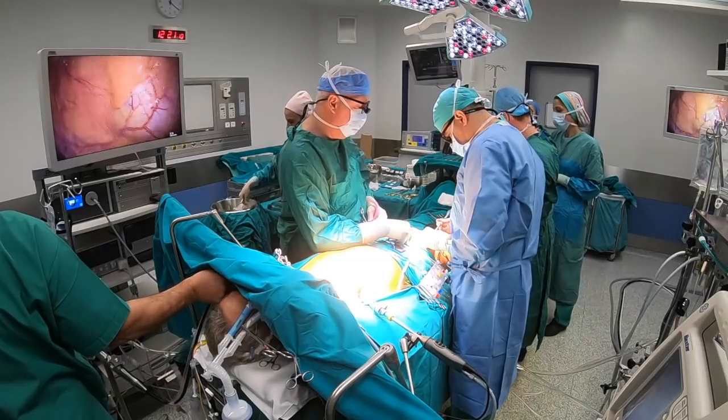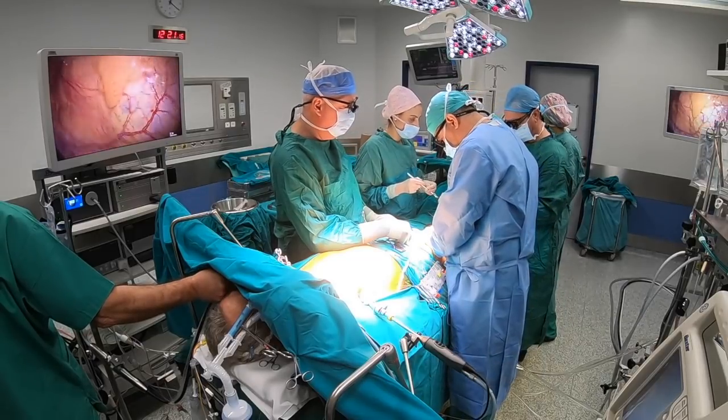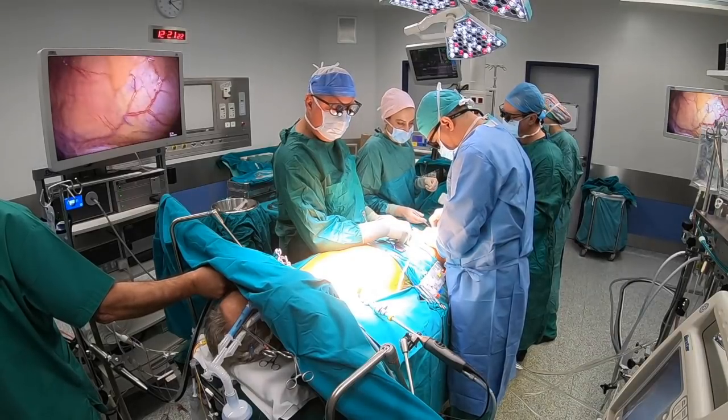All cannulas are inserted under TOE guidance. If we are to operate on the tricuspid valve, a separate right jugular vein cannula, 18 French, is inserted by the anesthetist.